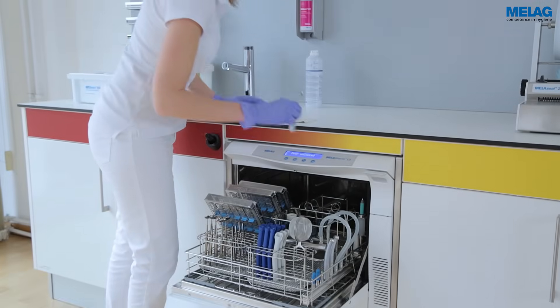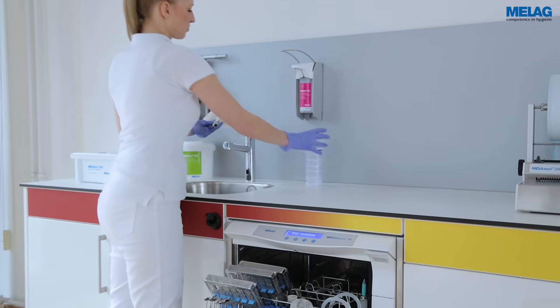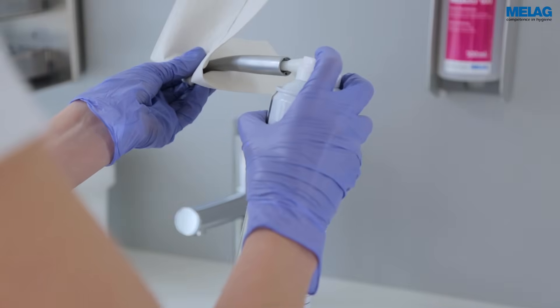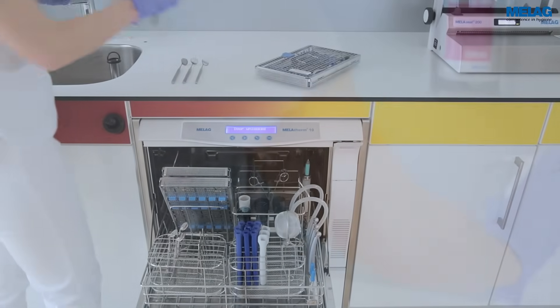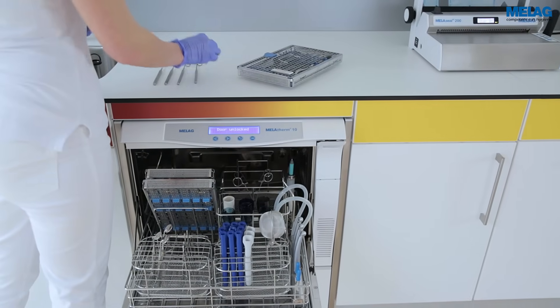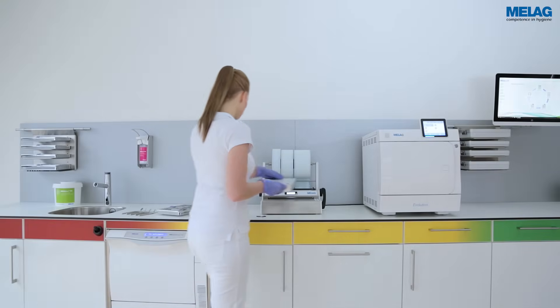Handpieces and turbines in particular require specialist care and lubrication in compliance with the manufacturer's specifications. Surgical instruments have to be wrapped for the sterilisation.